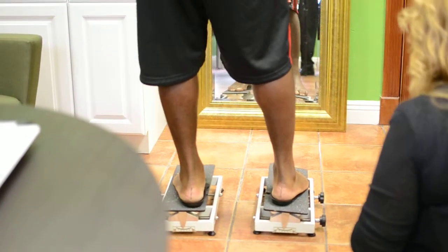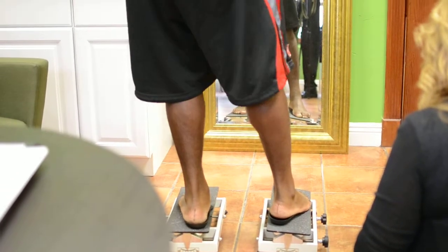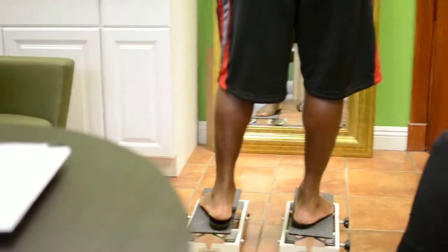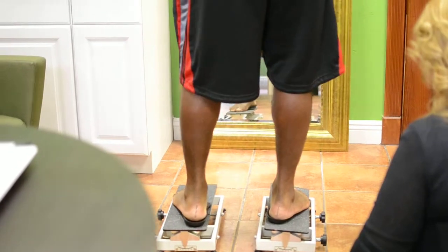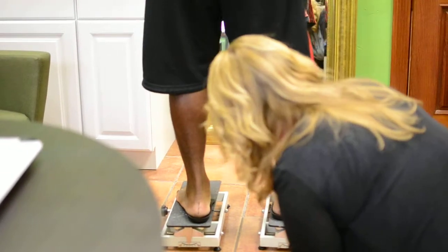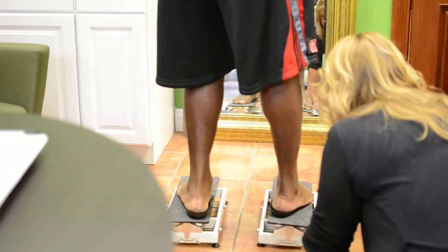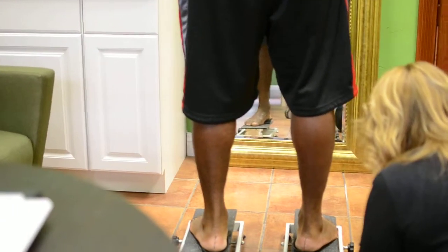You're starting to feel tired? We're putting it through the ringer — that's why his feet are swollen, we're grabbing and pulling at them. This is really diagnostic. He needs that balance training — the balance game, like part of yoga.